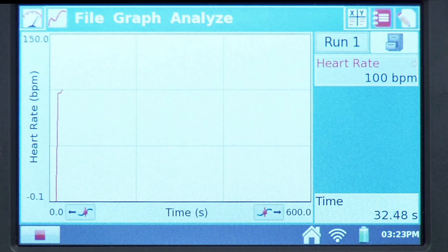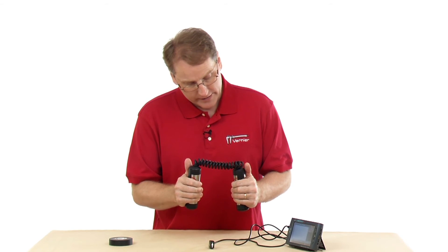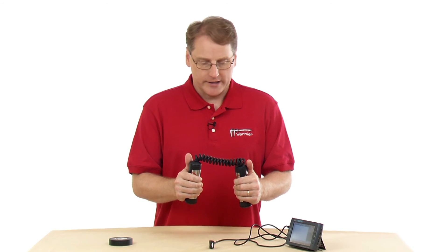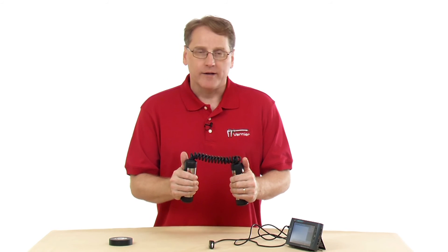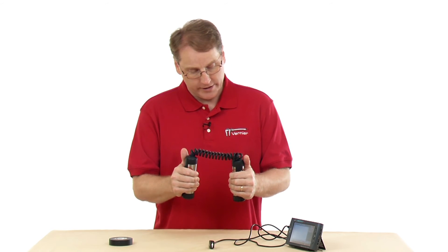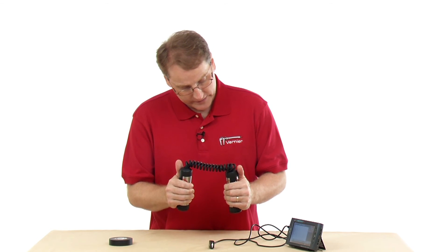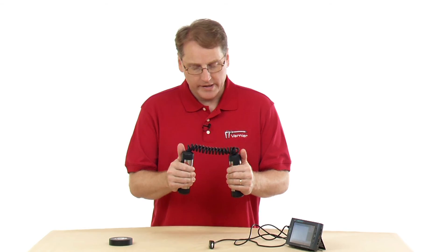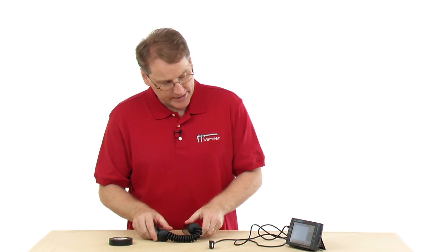As we go along, the heart rate value appears on screen and it's showing my heart rate. The default graph displays beats per minute. At this point you could start exercising to get your heart rate up — dancing around or whatever — to generate interesting data. I'll just sit here for a minute and let it collect, then stop data collection.